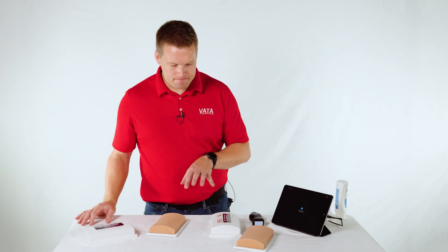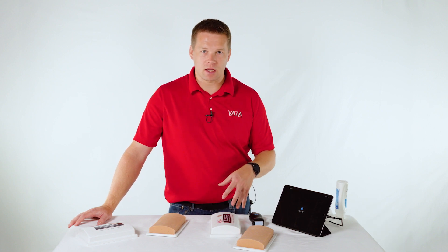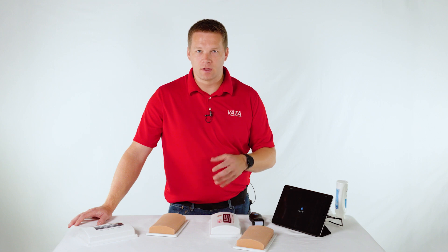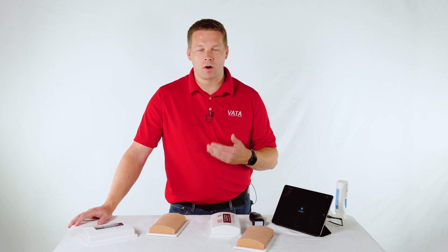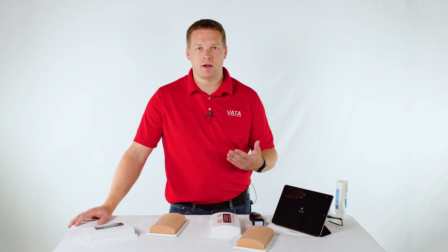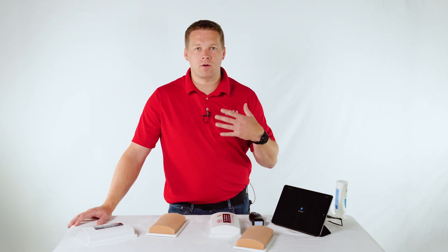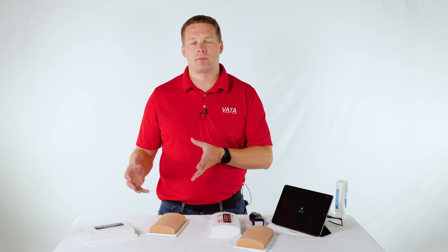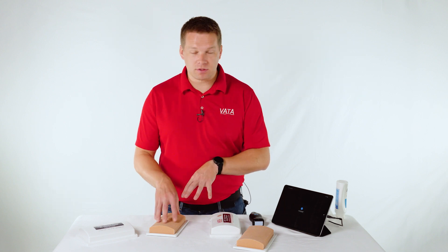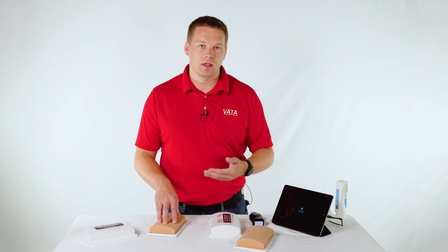With these models, the different vein configuration is always something to keep in mind when you're looking at which one to order. It does come in light and dark skin. As ultrasound is becoming more and more accessible, machines used to be very expensive and larger, harder to transport. Now you're seeing ultrasound machines at a much lower price point — some you can fit in your pocket — so nurses and other staff are able to have these at the patient bedside and use them for things like starting an IV.